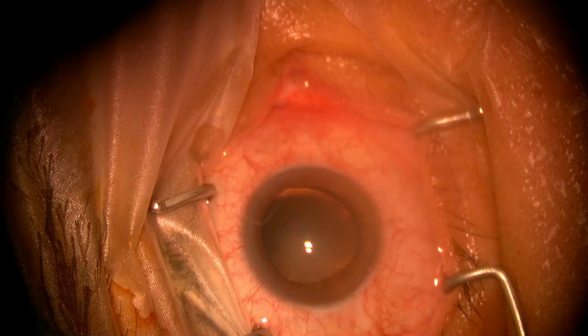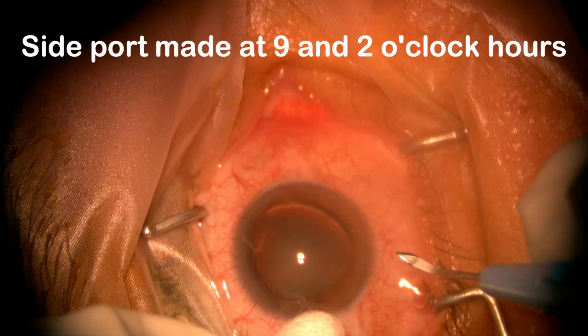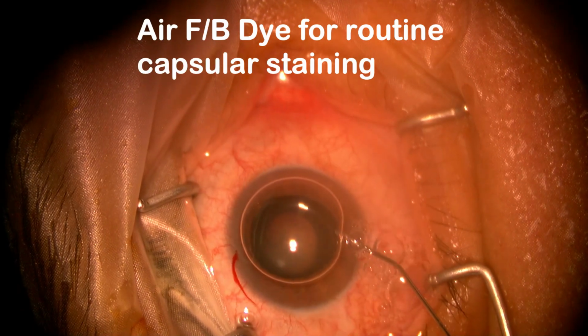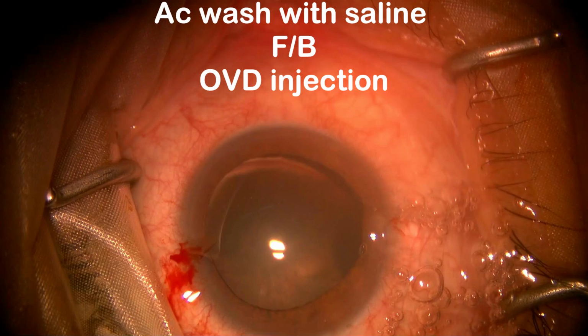Let's see case number 2. This is the case of traumatic cataract with subluxation of 2.5 clock hours. Side port is being made with an MVR blade. Air, dye, hydro and visco is being injected.